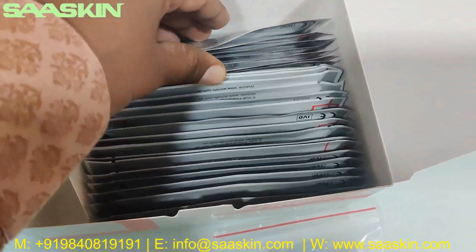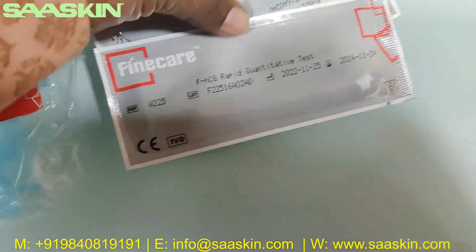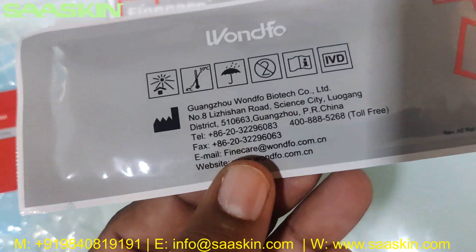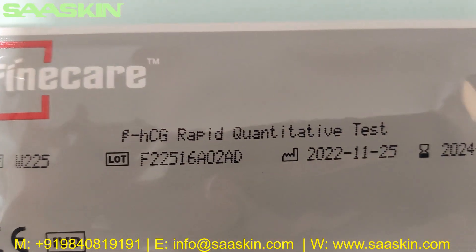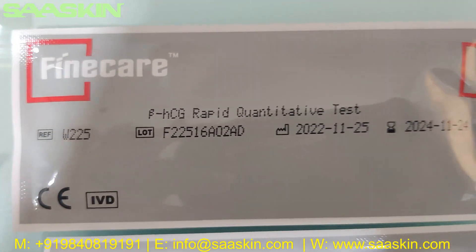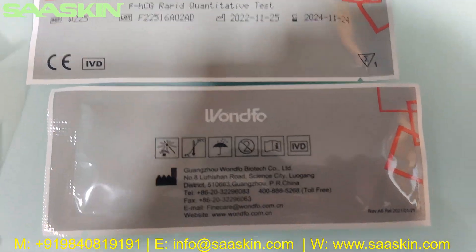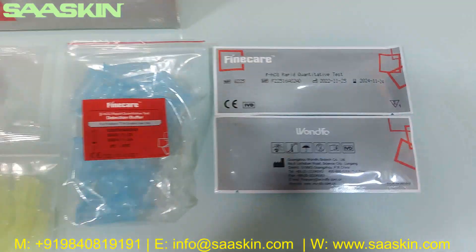If you go inside, you have 24 cartridge packs. You can see it says Finecare Beta HCG Rapid Quantitative Test. And you have the reference part number, lot number, and the manufacturing and expiry date. The CE mark and also the manufacturing location is mentioned on the back side of the pack.